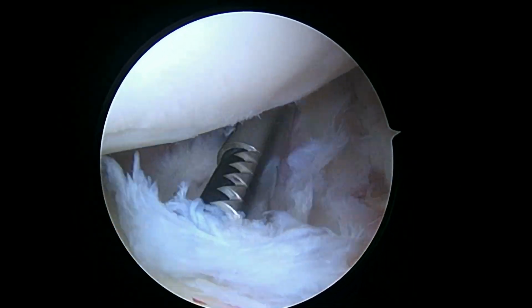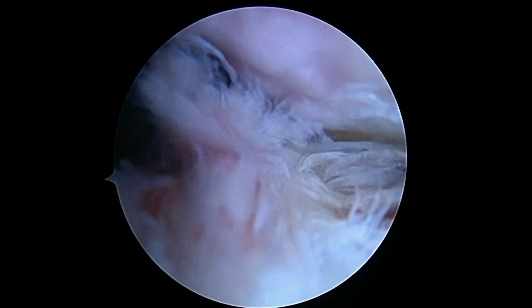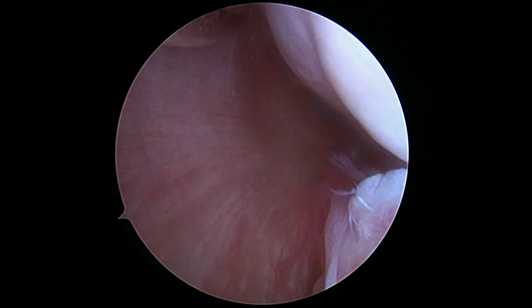So the biceps anchor's torn quite a bit. We're going to be doing a biceps tenodesis because of that. The other thing that's remarkable at this point is you have a lot of arthritis in the shoulder. So you've lost some cartilage on the glenoid here. You've got some kind of degenerative labral tearing in the back that we'll take care of.